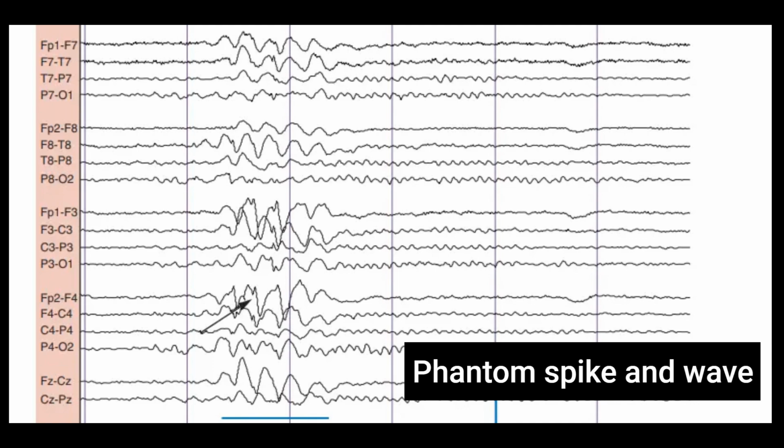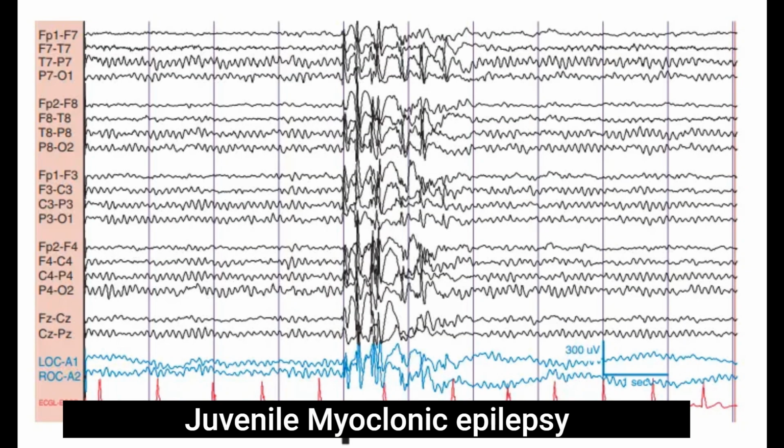I like that. So if they're benign, why is it important to even know about them? Because it's important to differentiate them from true epileptiform activity, so that we're not misinterpreting them. Okay, that makes sense.